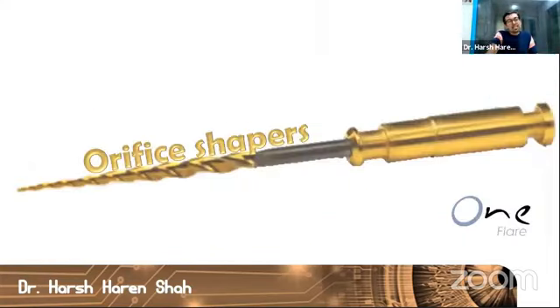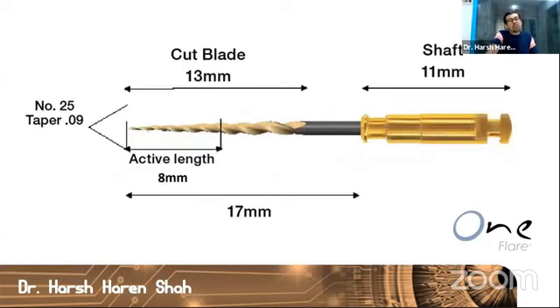Let's see the kind of instruments that we use for flaring the coronal 1/3 of a tooth. These are called orifice shapers, orifice wideners, orifice enlargers, flare files, etc. Let's see what are the ideal characteristics that you generally have in an orifice shaper. The file that you see here is a 1 flare, which is what I use. What I want to tell you about this file is, I'll just tell you a few points.